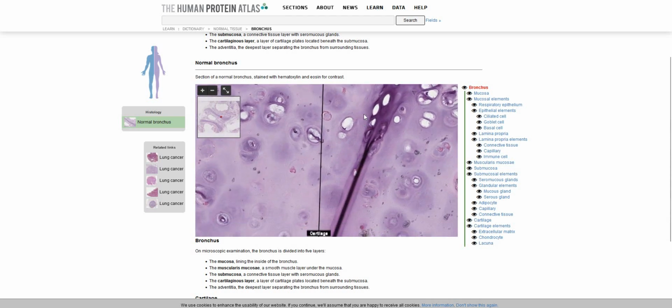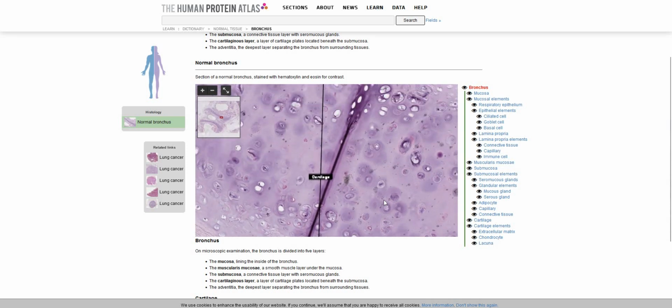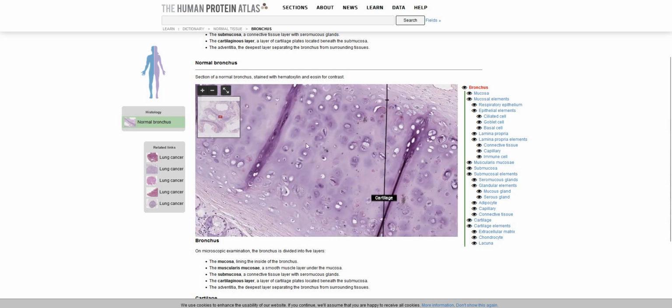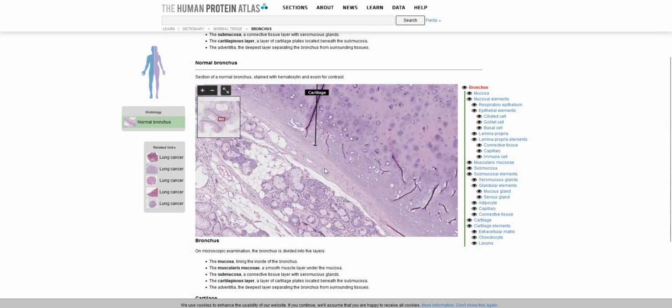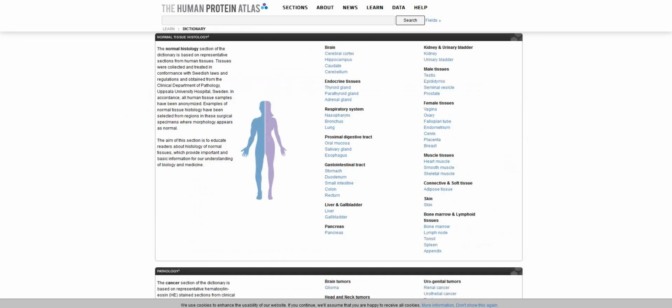We'll circle around to this concept again when we talk about the skeletal system, because there is a process in which bone is formed from cartilage called endochondral ossification. It's a mouthful, but we'll see some of that in slides like this, and I'll talk a little more about how we find those areas. Okay.